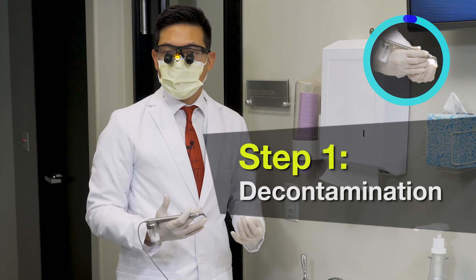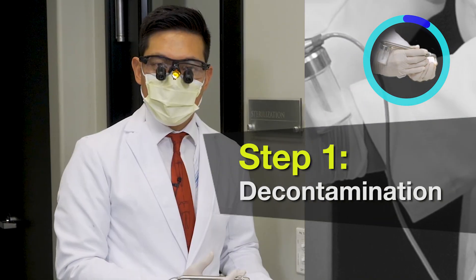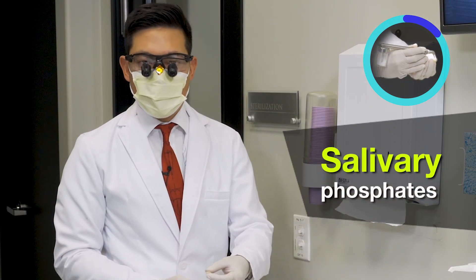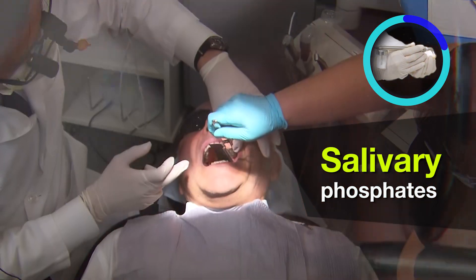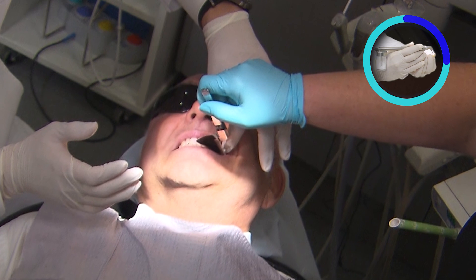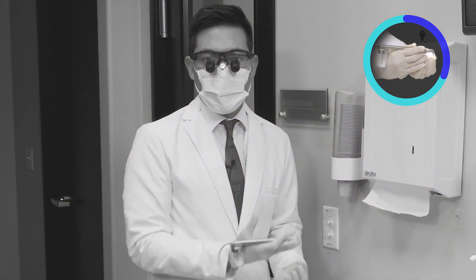One of the important steps when it comes to bonding Bruxer is to decontaminate the restoration after you've tried it in. When you try the crown in on the patient it becomes contaminated with the patient's saliva. Those salivary phosphates could certainly inhibit bonding — whether you put the correct zirconia primer or bonding agents, that saliva is blocking those sites.